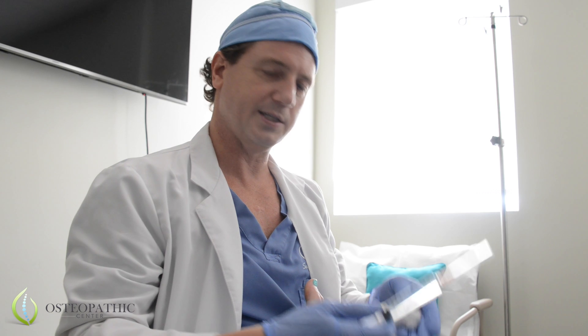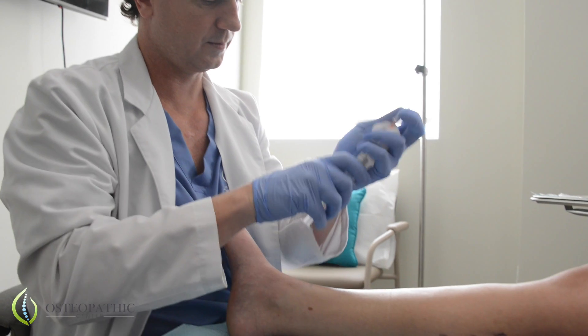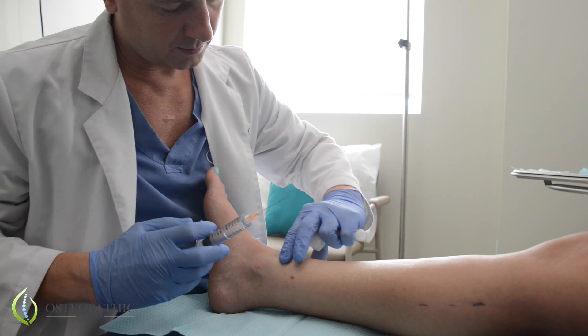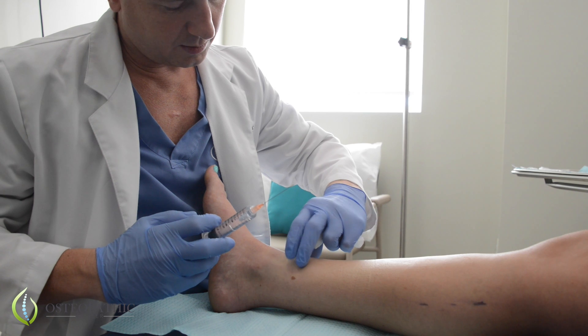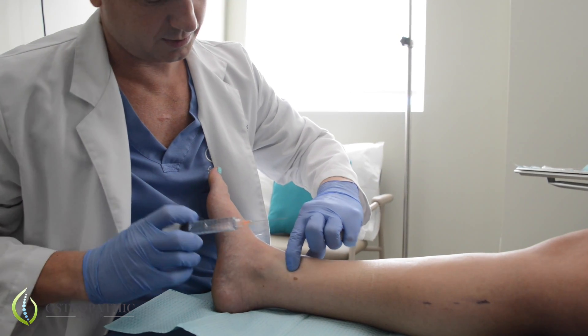So now this is our lidocaine diagnostic test — we go exactly to the point of pain and injury and look to resolve it afterward. If so, then we go forward with the regenerative injection. Feel that right there? Yep. Okay, that's where we're going.